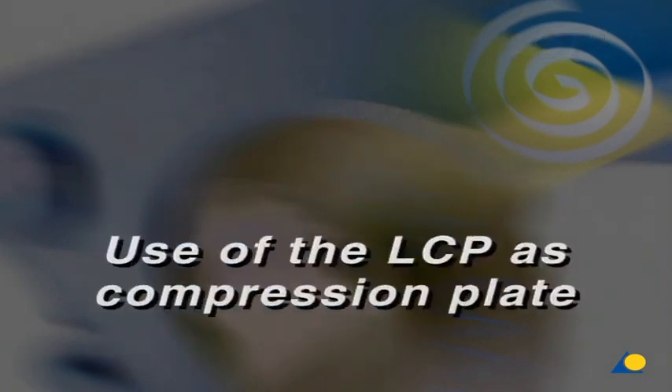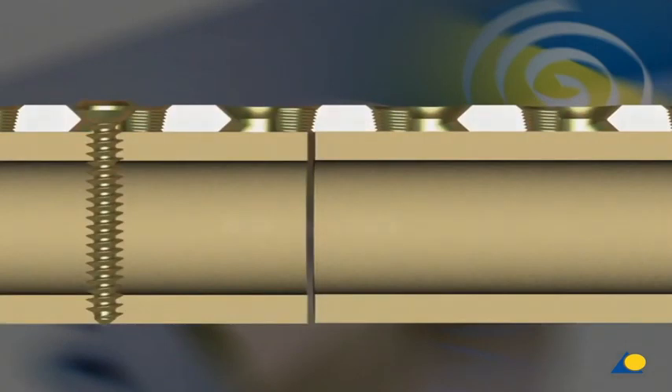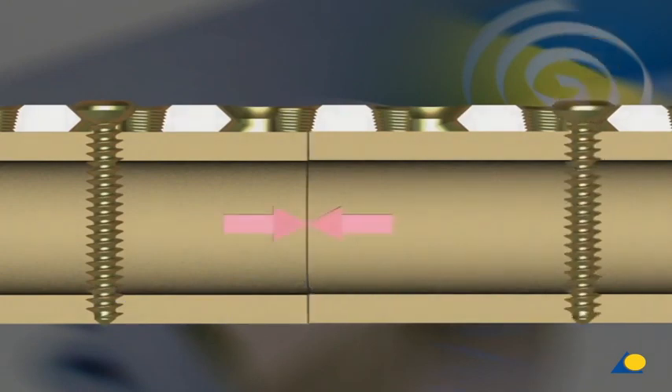Use of the LCP as a compression plate. The LCP hole is asymmetrical, and the orientation of the hole changes in the middle of the plate. In simple fractures, the LCP can be applied as a compression plate using the conventional technique. Axial compression, as in conventional plates, can be achieved by placing the screws eccentrically in the dynamic compression portion of the plate hole.